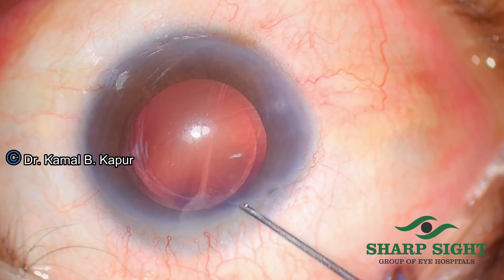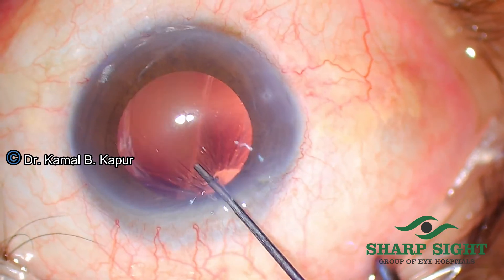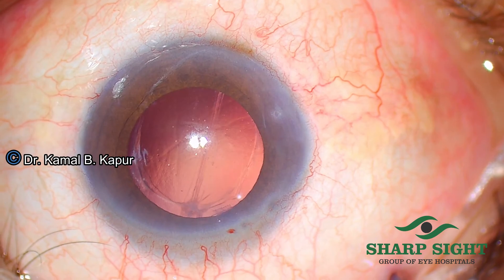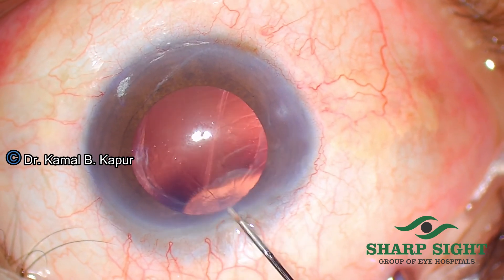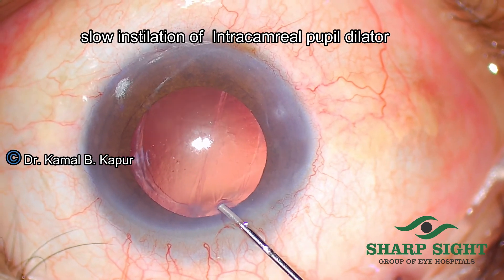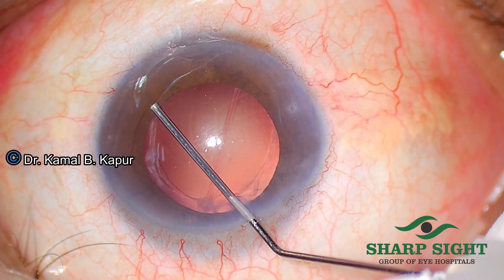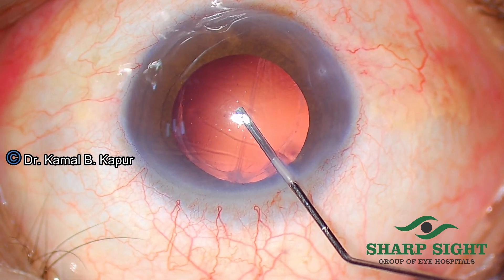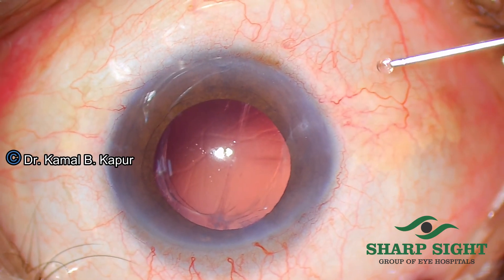You will notice how easily the initial incisions have been opened just by using a blunt instrument. We penetrate from the side port and inject a dilator drop to make sure that the pupil does not constrict during the procedure. We just make sure that we don't push it very hard to dislodge more vitreous coming into the anterior chamber, though the vitrectomy has been performed in this case.